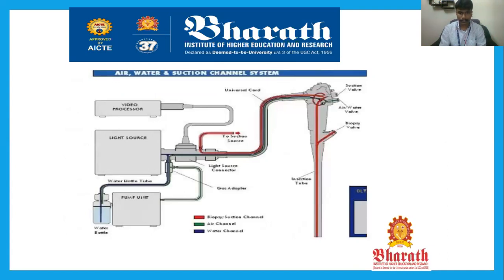And this is known as the channel system, which will be placed on the external surface. The fiber optics tube which is being inserted is known as the internal surface. For capturing the internal structure, a lot of setup will be made on the external surface of the human body. There will be a light source. This light source will be emitting light through the fiber optic material to view the internal architecture clearly.